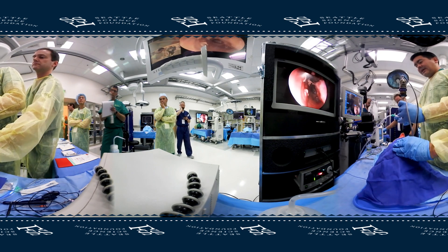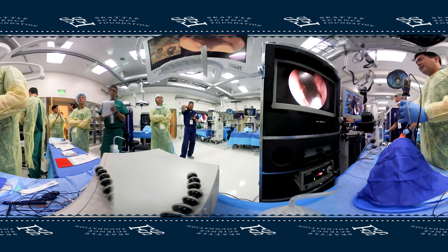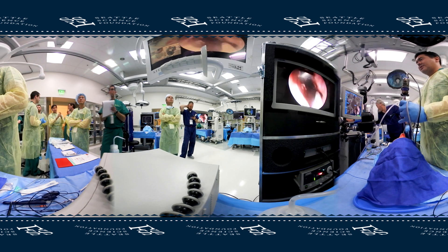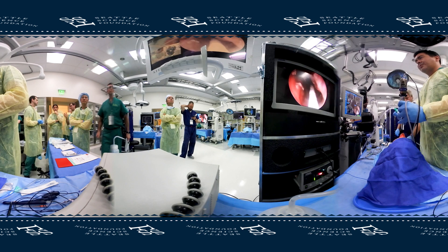For people with condemned mucosa or CF, you're making a large, dependently draining structured antrostomy that you can debride.